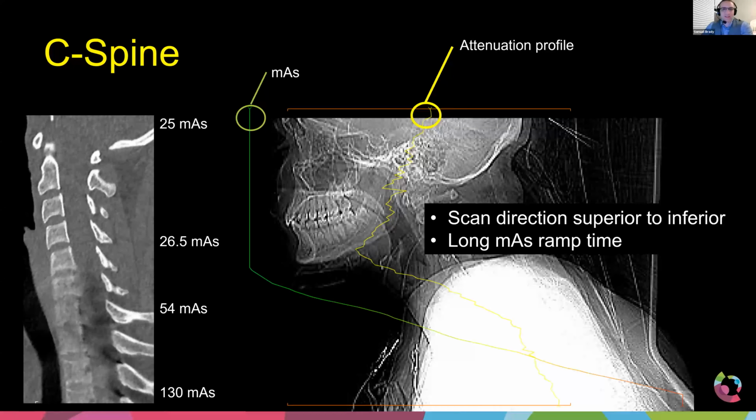There were 2 main things that we did to help fix this problem. Before I share with you how we fixed it, I'm going to share with you what we were doing. Initially, our patients would be placed on the scanner, and they'd have a scan localizer, an anterior-posterior, and then a lateral, which you see here. I am showing you the lateral projection, and there are 2 plots overlaid on this. They're a little hard to see, especially this yellow one that disappears into the white of the shoulder.